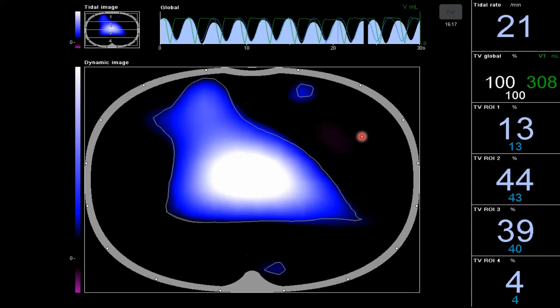So we're definitely having trouble here with the dorsal distribution. That's at 4%. That's why it's mostly black. Remember at the start, I said the blue really starts appearing when it's 10%. And when it's below that, it'll show up as black, but we're still able to get the information that there's 4% of the 308 that is still being distributed to the dorsal region.